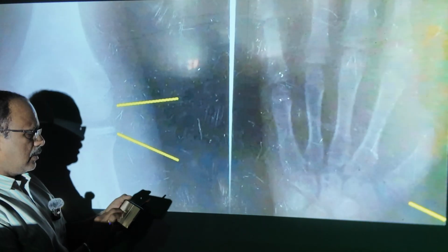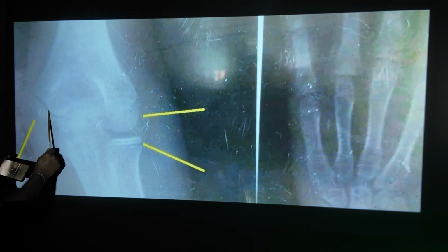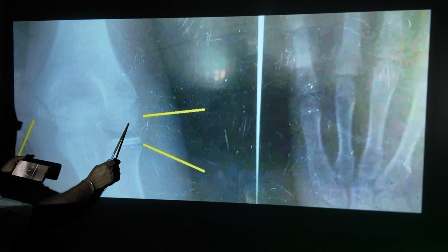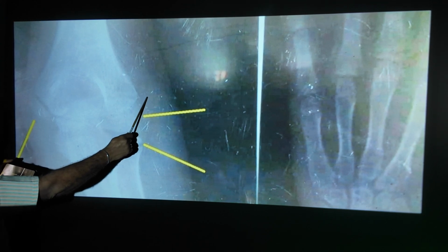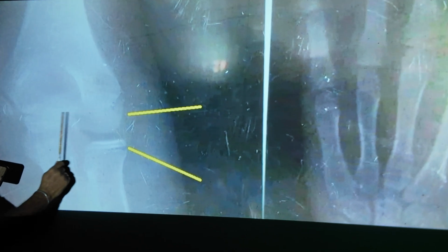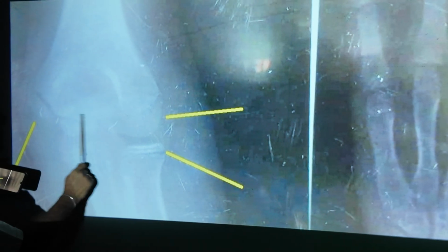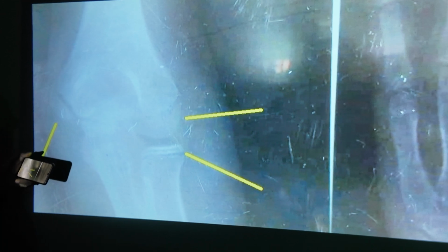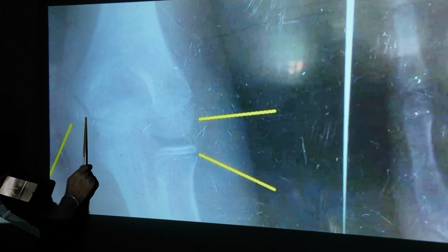Here we can see the elbow joint. Medial epicondyle appeared but not fused, trochlea, capitulum, upper end of radius, upper end of ulna, lateral epicondyle. Capitulum, trochlea, all three are fused but not fused with the shaft. Medial epicondyle appeared but not fused. Medial epicondyle forms a separate epiphysis. It will fuse with the shaft directly by the age of 16 years.